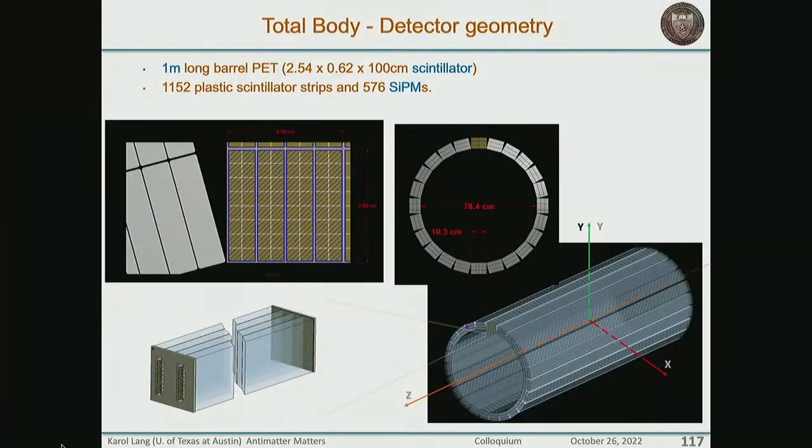So we started looking at it, inspired by a group in Krakow in Poland, where they do it using plastics. Why plastics? Well, because, as they claim and have proven, it can be relatively inexpensive. I didn't discuss prices here of these LYSO crystals and photodetectors. You can ask me and I'll be happy to tell you more about it. But the Krakow group had an idea what to do, and ours was a different design than theirs, but also based on plastic.